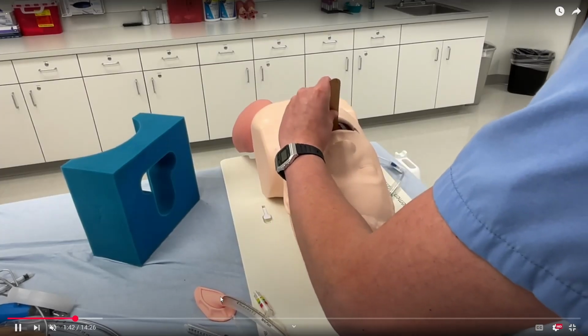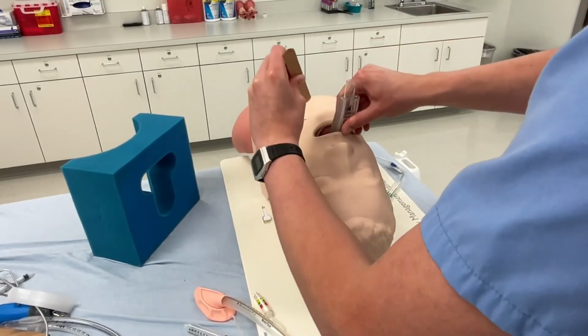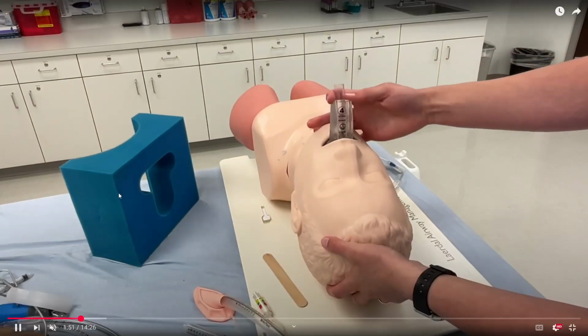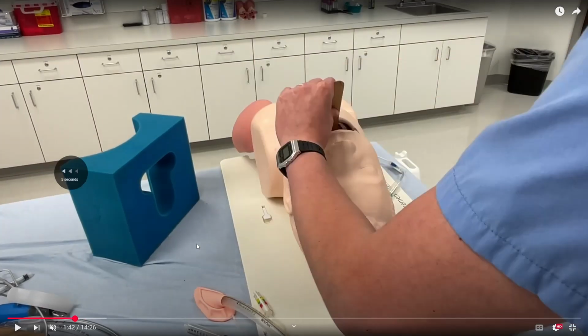So you can see the LMA. And then here's the I-gel going in. A little more straightforward of a process. Again, getting stuck, so I'm having to just shove it on in there. And then it's about that point. You could hook up the anesthesia machine or the ambu bag to confirm ventilation, and then carry on with the case. But very straightforward insertion process.